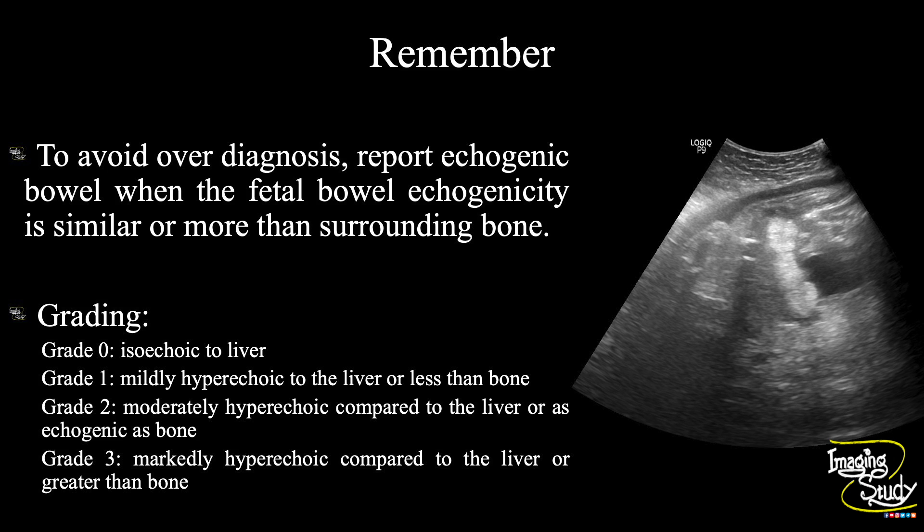If there is difficulty discerning whether the bowel is as echogenic as bone, one can progressively decrease the gain to see which structure disappears first. This is a good way to understand the difference in echogenicities among bone, liver, and bowel.